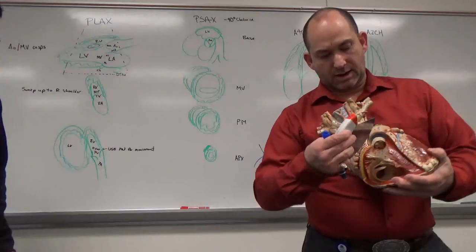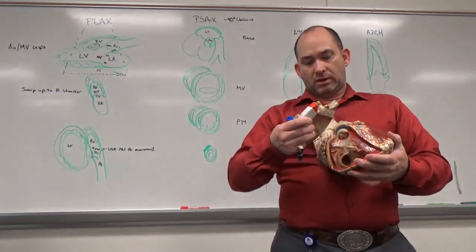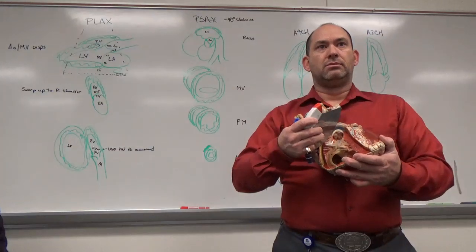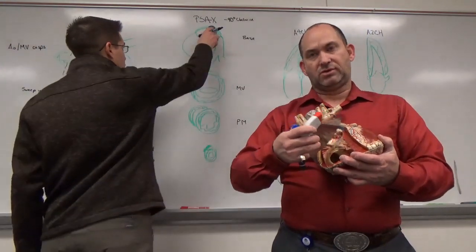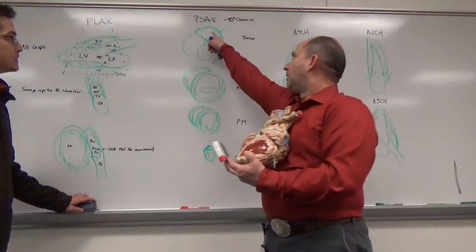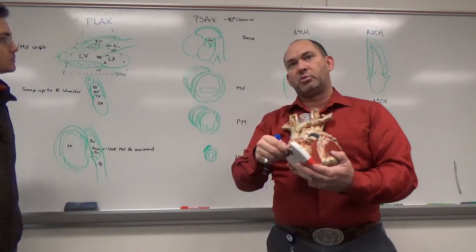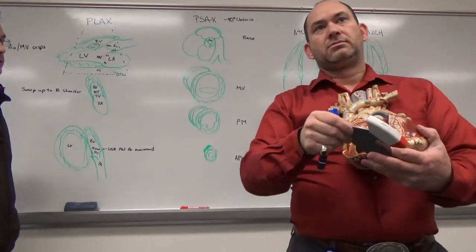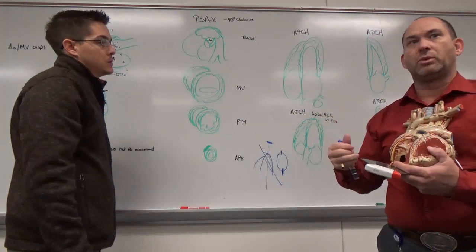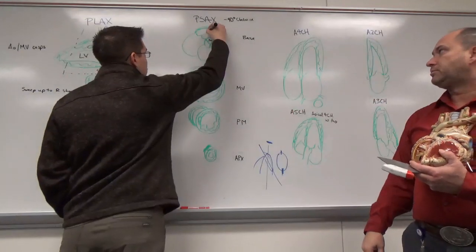Okay, now we're 90 degrees to the valves here, the top 3 valves. So, what's the first thing we hit? It's actually a ventricle. So, couple clues. Thickness of the wall. Other clues, look at the valves. Which way are the valves pointing? Into it. So they go into the chamber that they're going to be supplying to prevent the backflow from going the other way. So look at the valve. So we know that this is right ventricle because of the thickness of the wall.